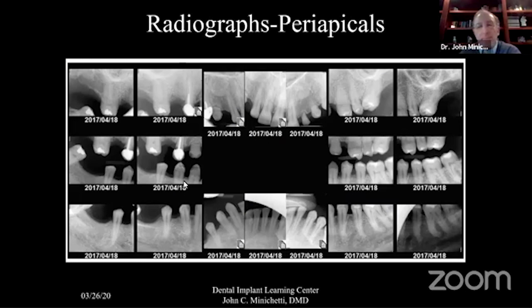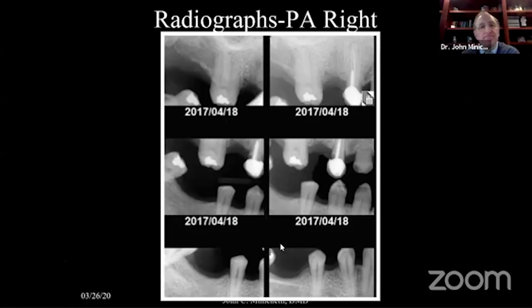And here's a periapical full mouth series. I'll look at that a little bit more closely in some of the larger images I'm going to show in a second. And I think that's one of the important things: sometimes when my students are sending me x-rays, it's very important to look at the periapicals also, along with any panoramic or CBCT images we have.